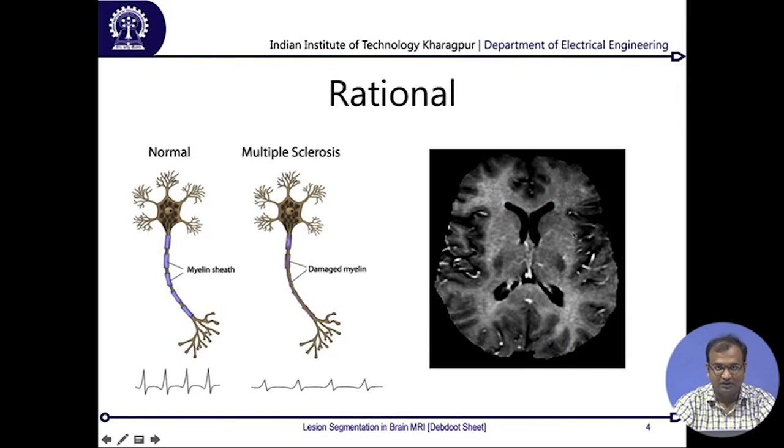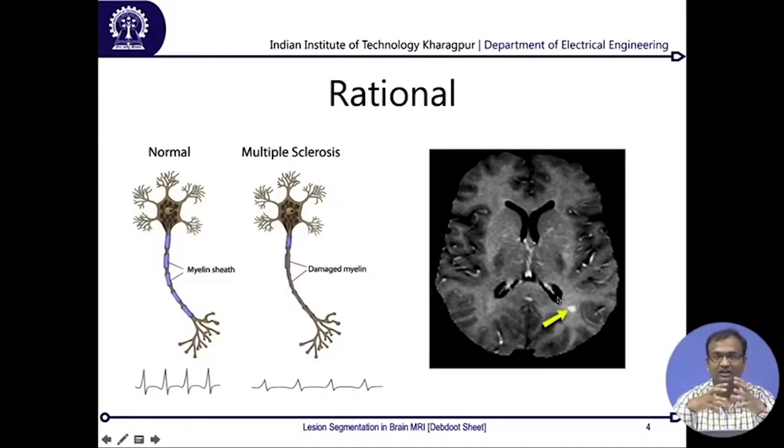These bright spots are from the same person who had pre-symptoms of being affected by multiple sclerosis. Longitudinal scans were taken: the person comes in for the first time, one scan is taken; then after six months another scan; then again after six months another scan. Every six months you keep repeating and look at the study across time — this is called a longitudinal study. For this challenge, longitudinal datasets were released for all subjects, making it much more interesting. You have 3D data of the same person's brain affected over different periods of time, and you can try to localize how the MS lesion has been moving around in space, making this a quite challenging and interesting problem.